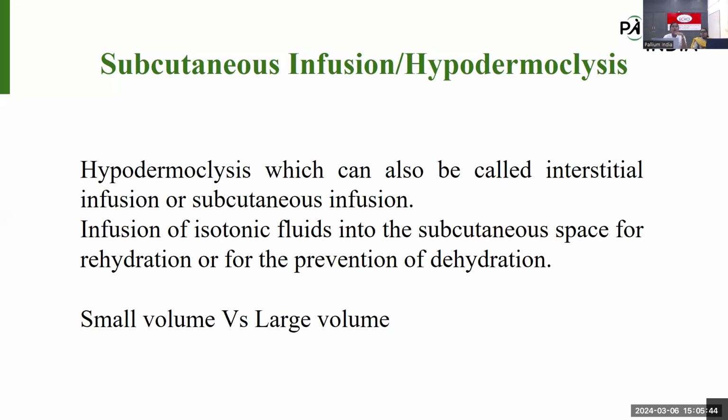Here we are introducing an isotonic fluid into the subcutaneous space for rehydration or for prevention of dehydration. The main thing is we are not talking about a large volume. We are talking about a small volume of fluid, introduced into the subcutaneous space.